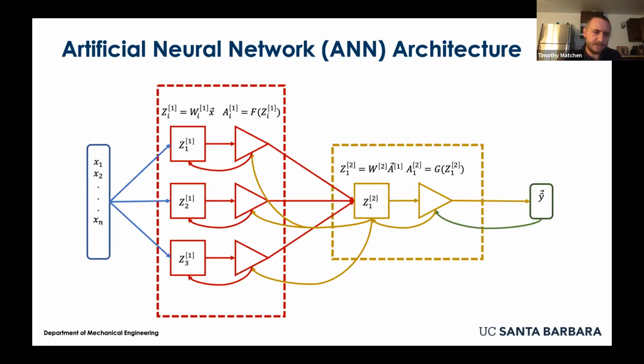So everything that we do in this talk is going to be based around utilizing slightly different architectures for neural networks, but they all have the same basic structure. We have an input, we map it through several hidden layers to an output layer. And in terms of these arrows, one nice thing about neural networks is they have a very straightforward training method. You have a forward propagation step where you pass the input through everything.